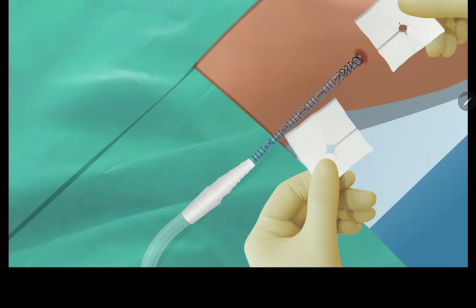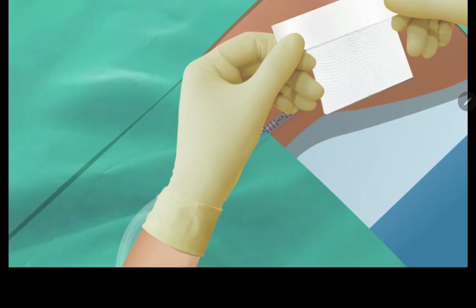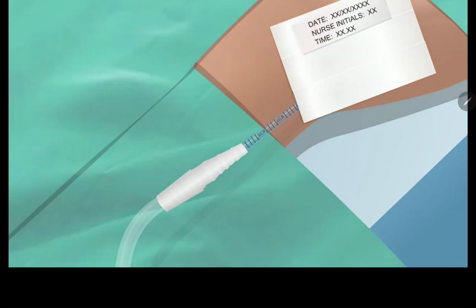Place split drain sponges around the chest tube, one from the top and one underneath. Cover them with a gauze dressing. Apply foam or a similar all-direction stretch water-resistant tape over the dressing. Label the dressing per the organization's practice.